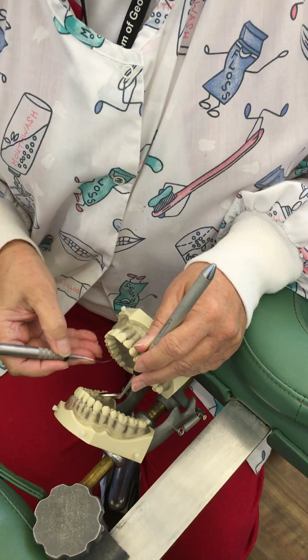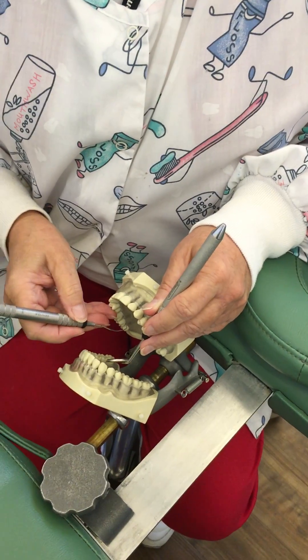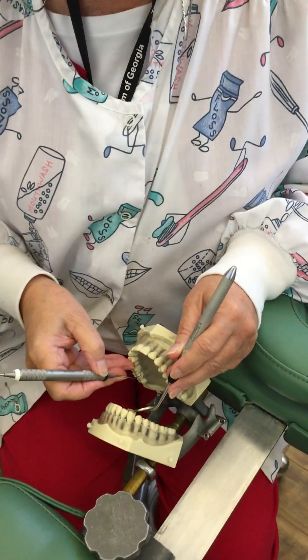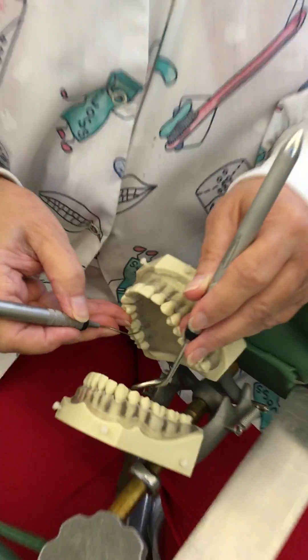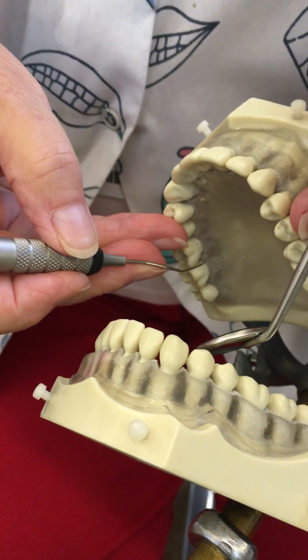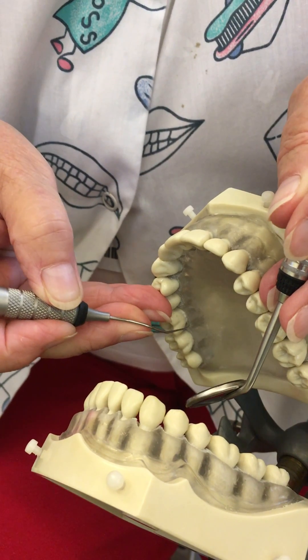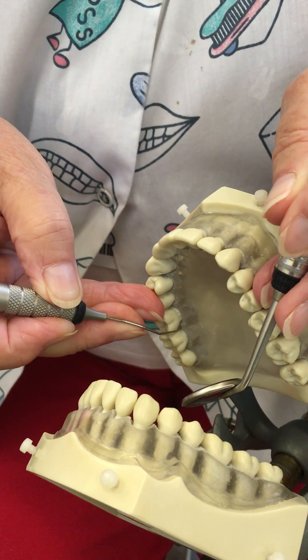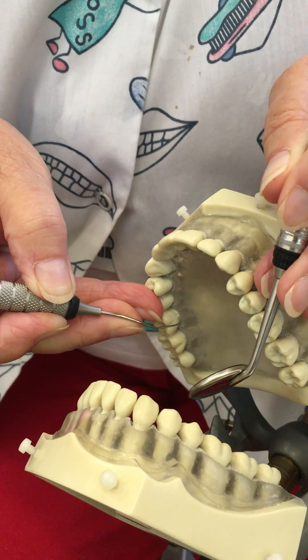Using the 12 instrument, I'm going to piggyback but I have to first decide on the correct end. I'm going to plant or establish my fulcrum, with my palm facing toward the maxilla, and point my toe on any one of the proximal surfaces or along this group. Look in the mirror so that you see it the way I'm seeing it.